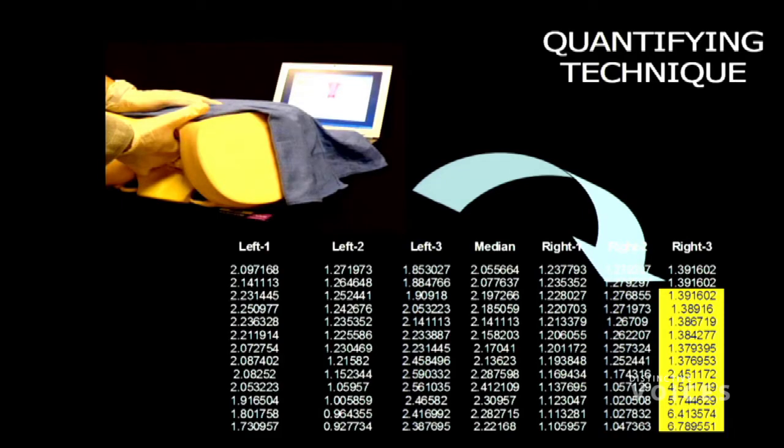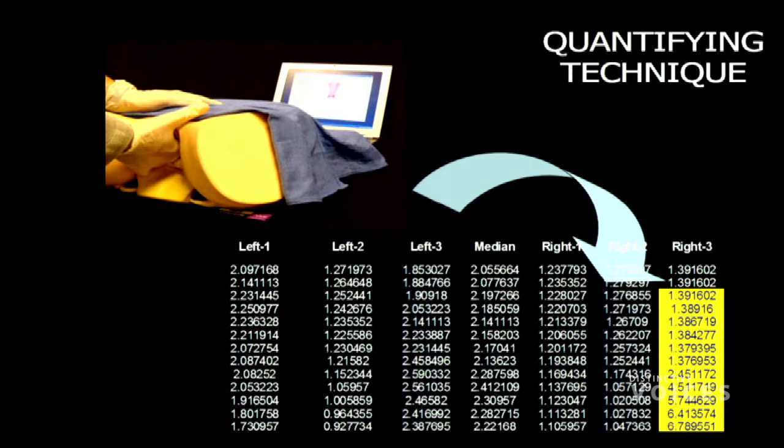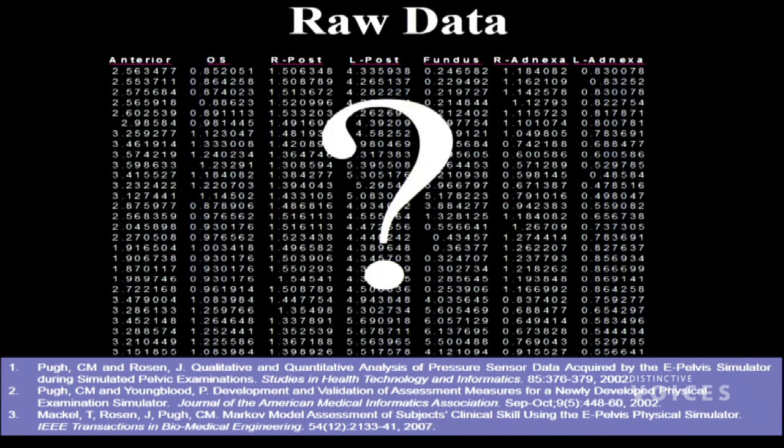And this is an example of some of the data. It's less than 1 second worth of data, but the highlighted area shows a sensor going up to 6 pressure units, and it goes back down to normal. But this is the data that I was able to collect from the model. And that's pretty much been the source of my research, really raising the question, what does this mean in terms of performance? And so I've collected data on several thousand people over the past 14 years looking at this, and I've also instrumented other models.